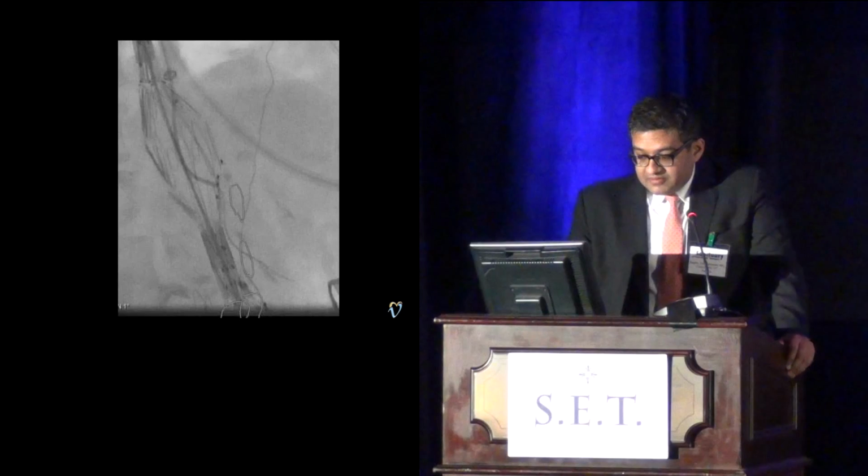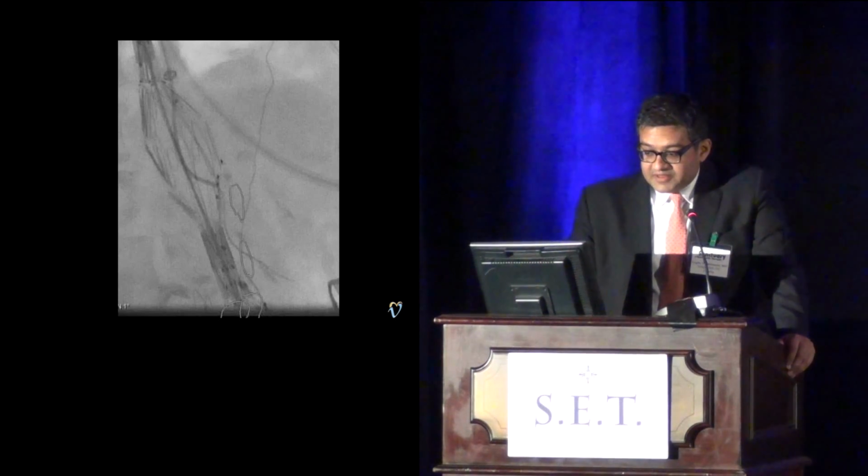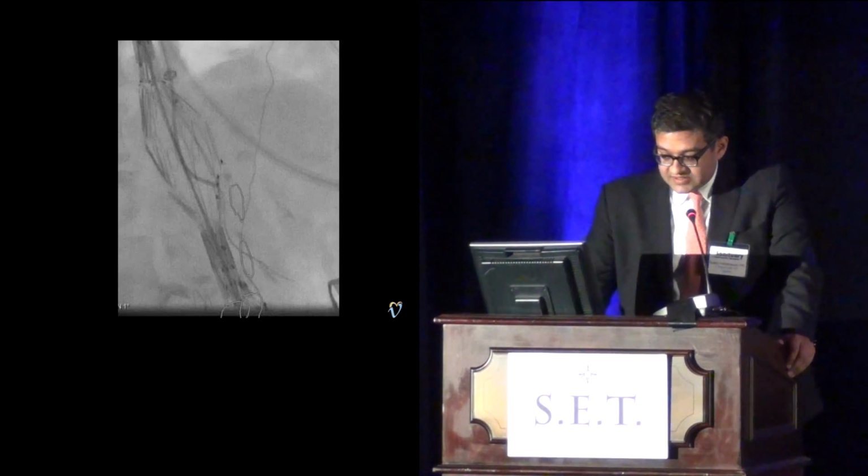Following this, initially from the upper arm through the access scallop, the catheter could be placed in the endograft. Here the wire is in the SMA, but that will be easily redirected in the next slide. And you can see this is only partially deployed at this point. This allows full control and easy maneuverability to rotate the device, especially in a complex 4-vessel device such as this.